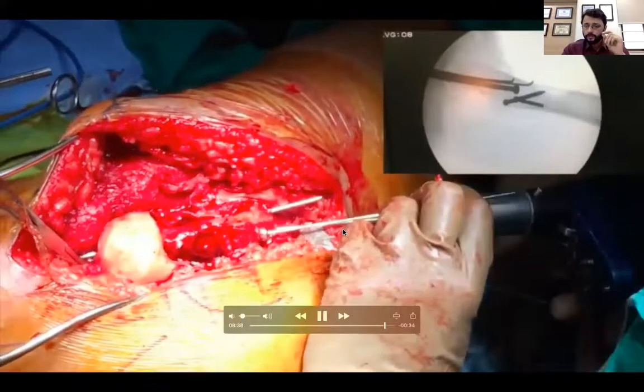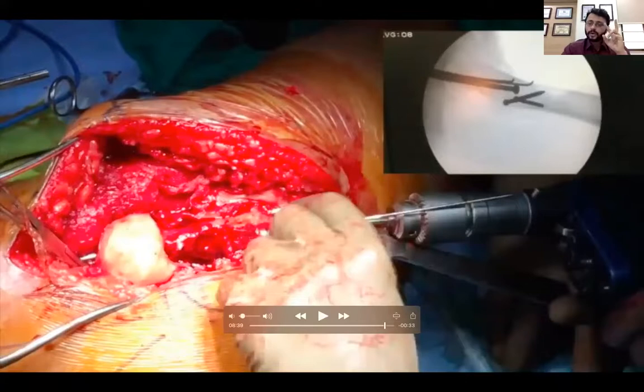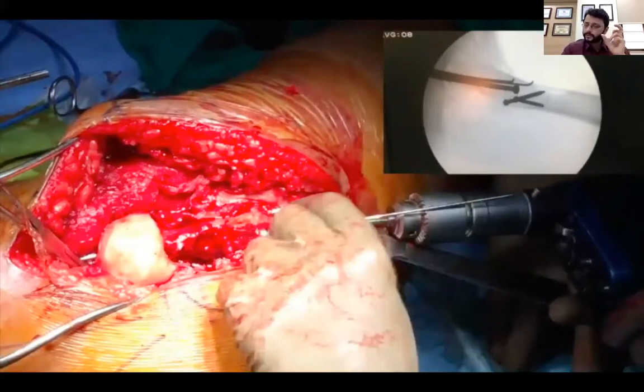Now there is one tip which is always important, which is that you should have long screws of 3.5 mm diameter, which is the typical size, about 50 to 55. And remember, the usual 3.5 mm set ends at 40. So you should tell your implant guy to see to it that you have long 3.5 mm screws. That is one thing. And secondly, always remember to order two drill bits. This is one thing which I always tell the primary surgeon to check. Two drill bits for 3.5 mm screws.